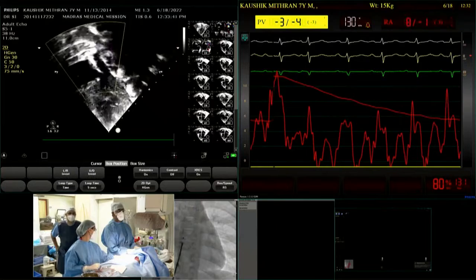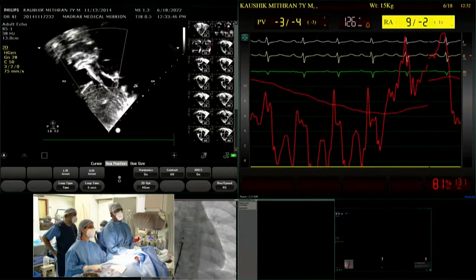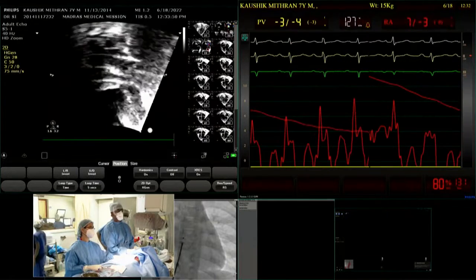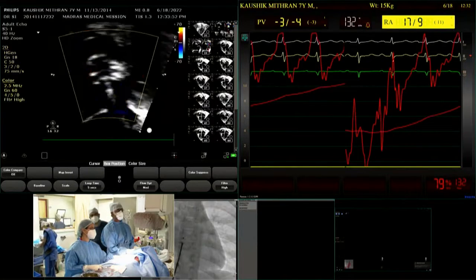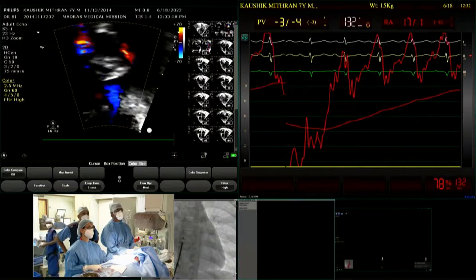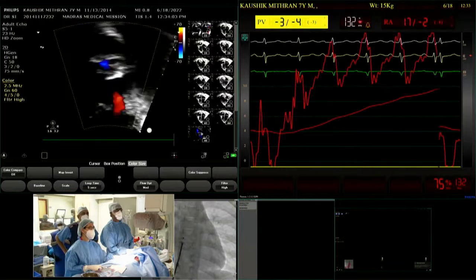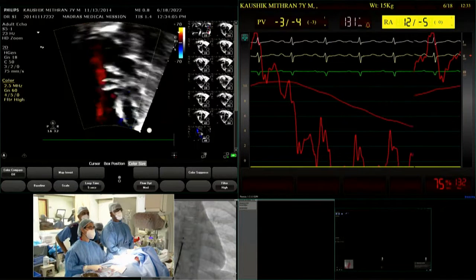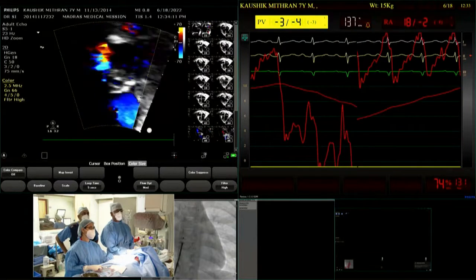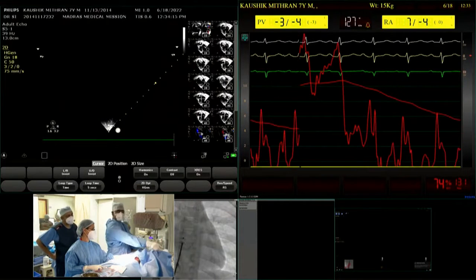Because you are not getting the hemodynamics properly. Child cannot live with the saturation of less than 85% at all in a normal AV-VA concordance with borderline RV. So I am going to agree with the steps which are done in this particular case. Probably your RA disc is pulling and the defect is getting opened, the superior defect close to the SVC. Even though you are not demonstrating properly by the echocardiogram, your contrast indirectly is suggesting that.